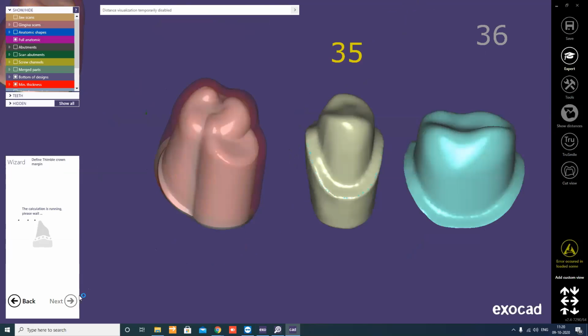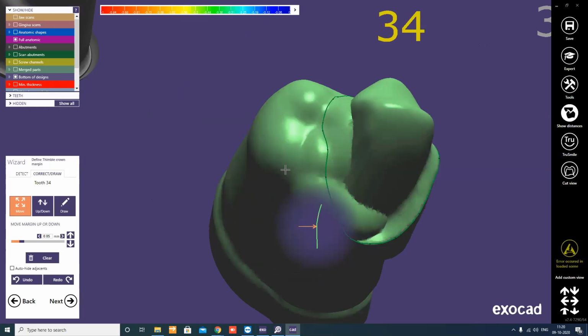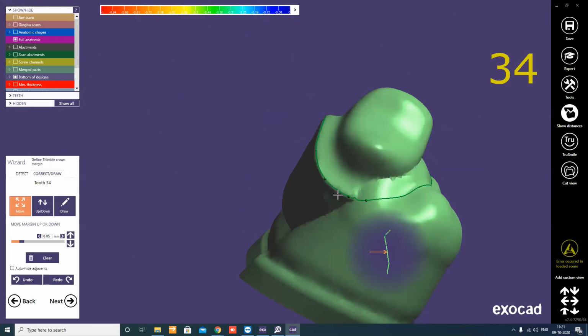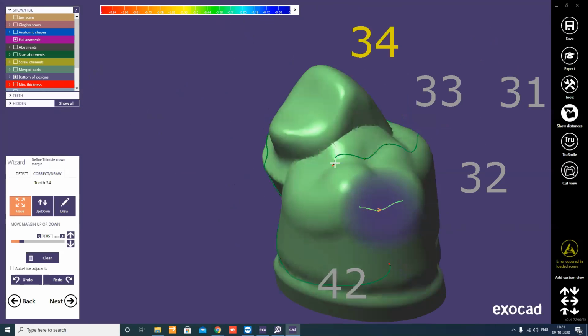So in one step, I could show you the custom abutment and the Malo bridge cementable. But if we choose the order differently, I have to design it. This is where the CAD is confused. He says, "Hey, I don't understand. What do you mean?"